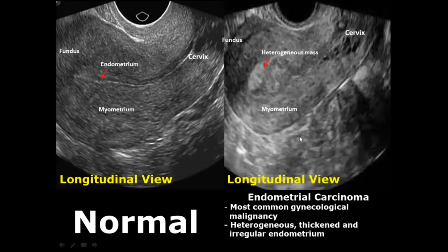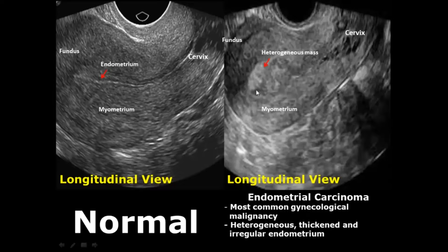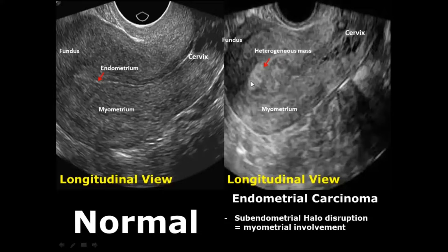Endometrial carcinoma is the malignant condition of the endometrium. It gives a heterogeneous appearance with thickened endometrium showing irregularities in its texture. Another important feature is the disruption of the sub-endometrial halo — a hypoechoic area in the innermost layer of the myometrium right behind the endometrium.